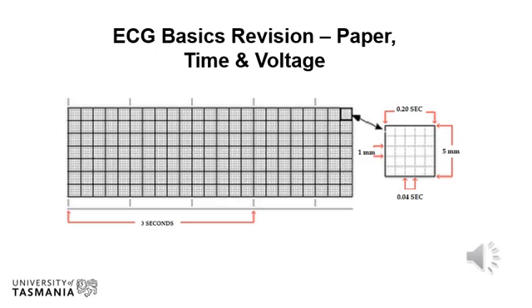It also tells us if it's beating regularly or irregularly, and if all the events that should be occurring according to the electrophysiological aspect are actually occurring mechanically. And if they are, it should tell us if there are any delays. So all of this information helps us decide if the patient's heart is functionally normal or abnormal, and it can also tell us the degree of abnormality. So essentially, are they critically ill?